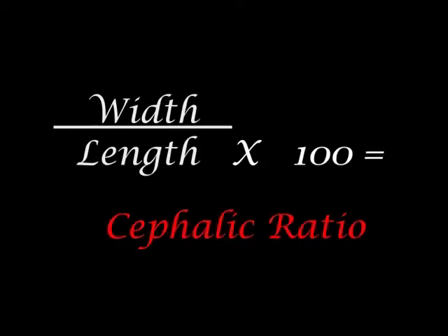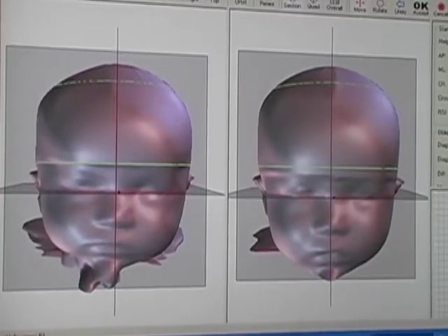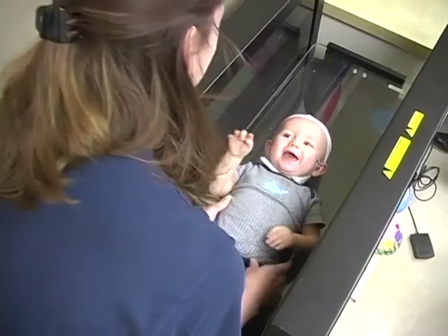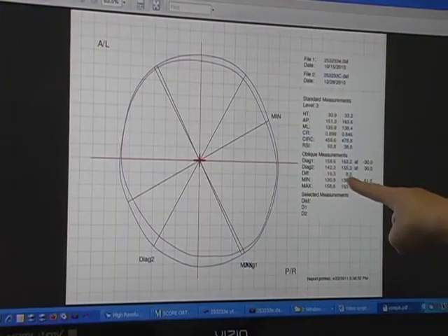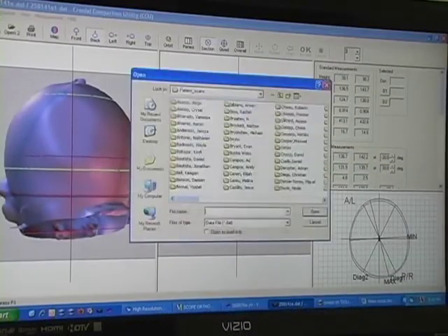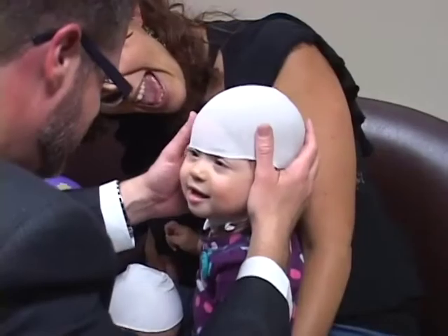The cranial vault and cephalic ratio are tracked throughout the treatment with comparative scans. Your practitioner will take scans at follow-up appointments when a significant amount of growth is measured in the total circumference of the head. These follow-up scans will be aligned with and compared to the original order in order to accurately track the growth in desired areas and to ensure growth is being curbed in the holding areas.